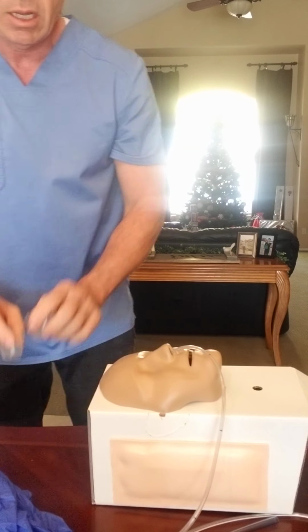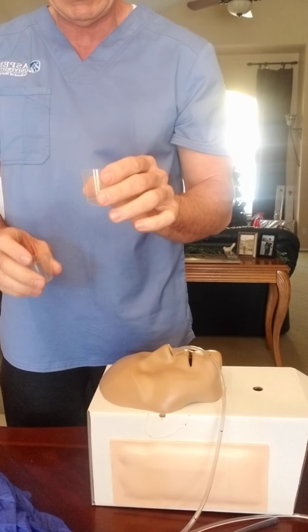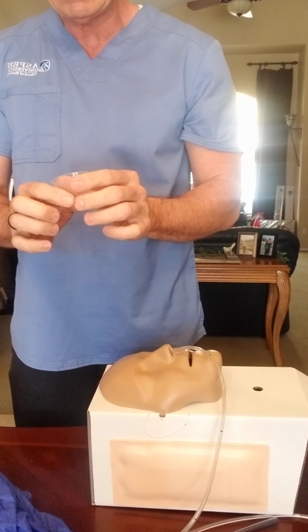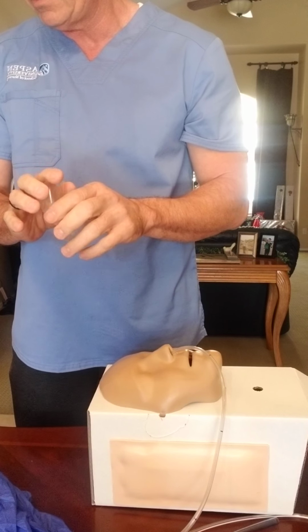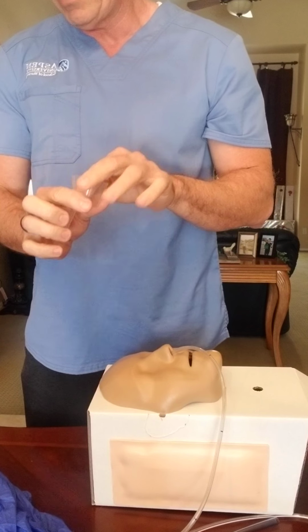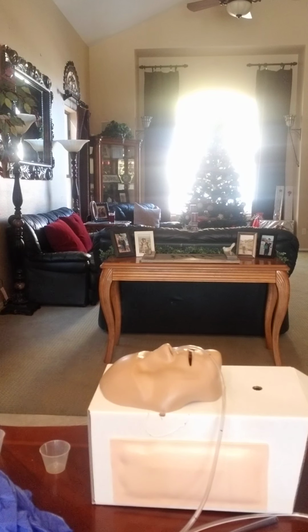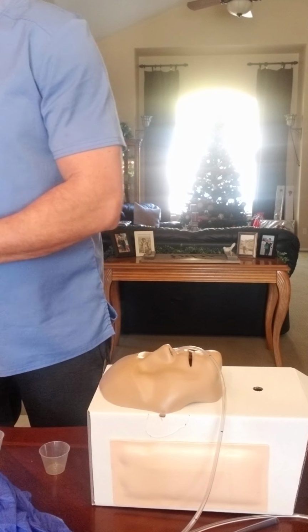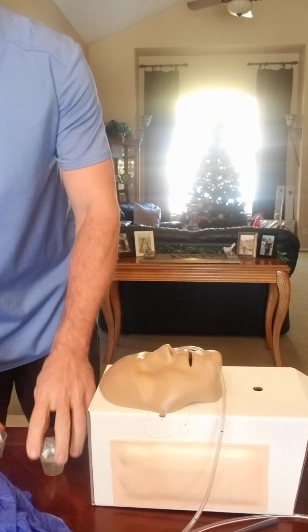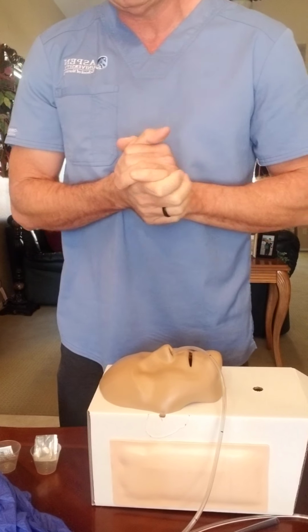I'm going to go ahead and crush the medications, and I'm pretending that I have my crushed medications in here. I'm also keeping the label for each medication to bring in my little med cup to bring with me to the patient's room. That way I can scan them and then show the patient exactly what I'm giving him.